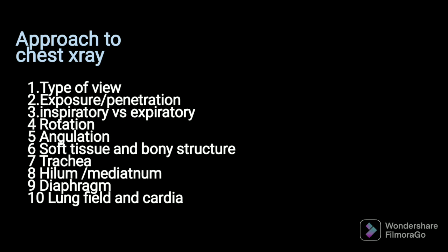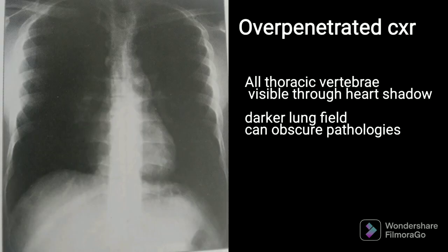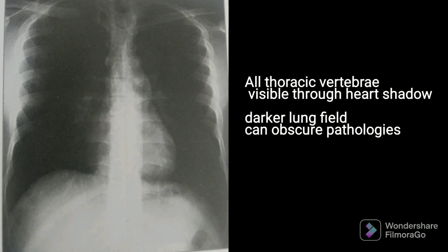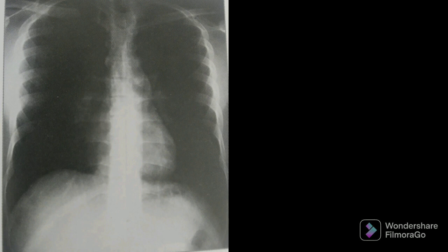We will start first with an over-penetrated chest x-ray. This is how an over-penetrated chest x-ray looks. We have two features: the first is that all thoracic vertebrae are going to be visible through the heart shadow — even the bony details are visible. The second is that because of a darker lung field, there can be obscuration of certain pathologies.